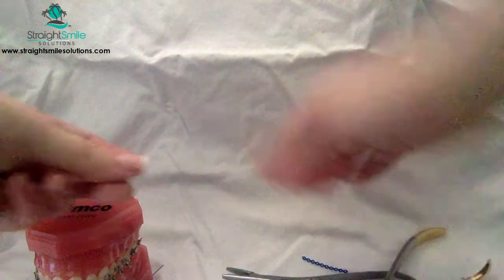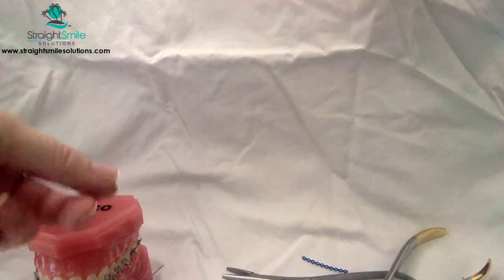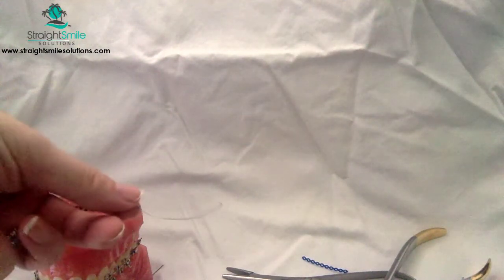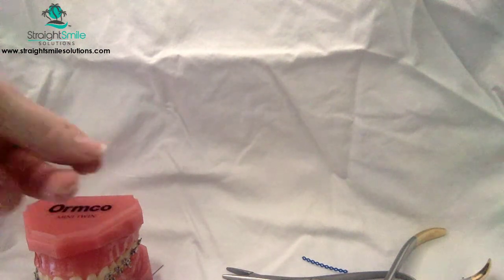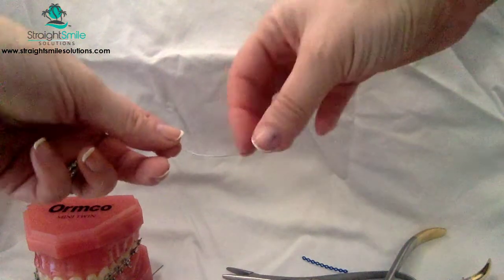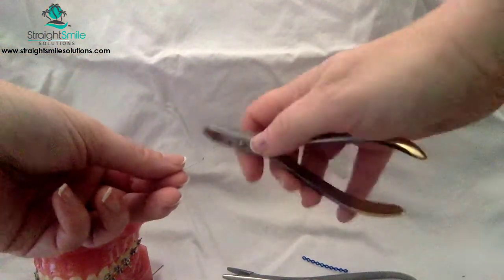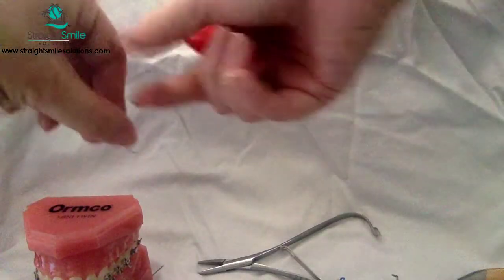It's also great in an initial wire if you're afraid it's going to pull out the back tube. You can go ahead and measure how long you want it to be, leaving about 2 millimeters from the end. Pull it back out, then cinch it, and then put it back in if you can get it around there. Or you can cinch it, anneal it, heat treat it. I don't know if that made sense. Let's try it this way.